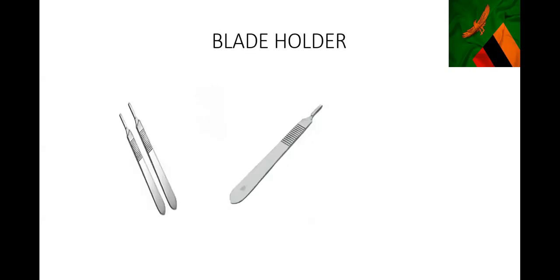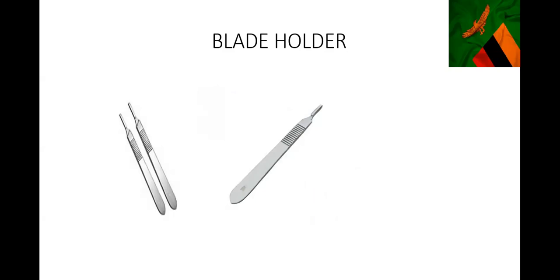These are blade handles - also called a Bard-Parker. It's acceptable to call it either a blade handle or Bard-Parker. This is where we attach the blade and then do our surgery. This is a needle holder. You can see that the handle is really long, and the part which you use to hold the needle is quite small - that is one identifying feature for a needle holder, also called a needle driver.